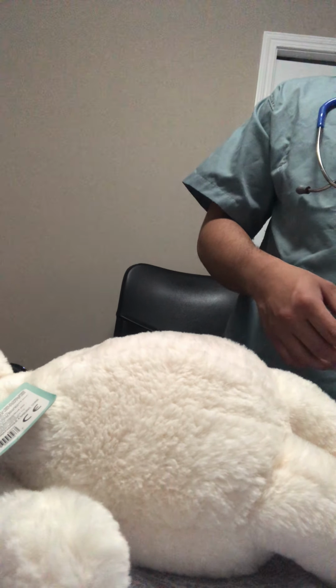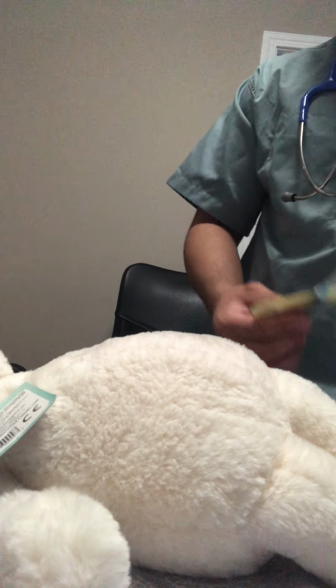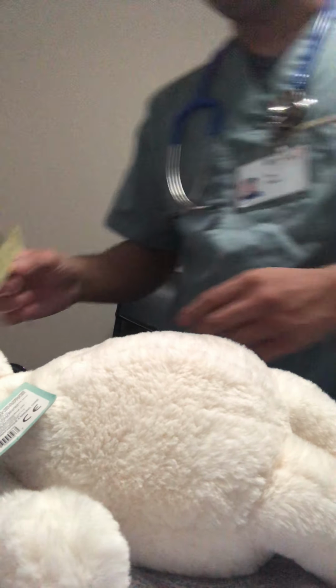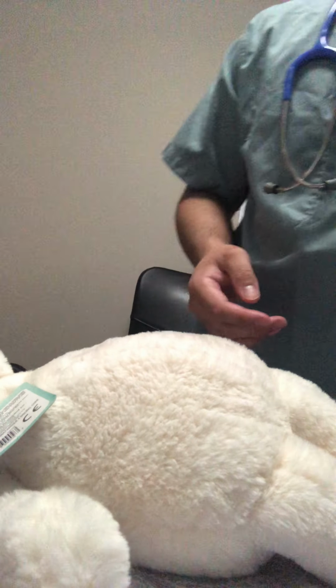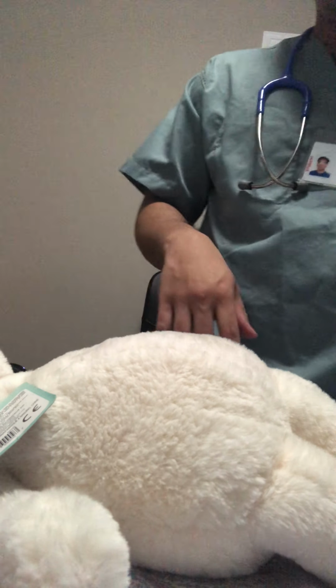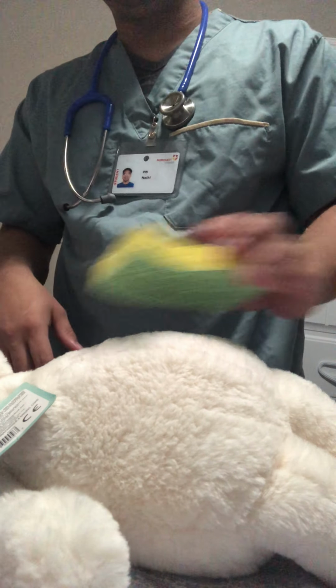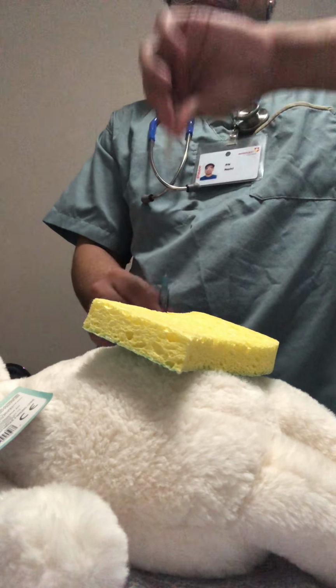Okay, now that I have told him about my patient teaching, I'm going to proceed to administer the medication. So I'm going to apply hand hygiene and apply gloves. Let's pretend this is his skin. I'm going to do the rainbow effect.